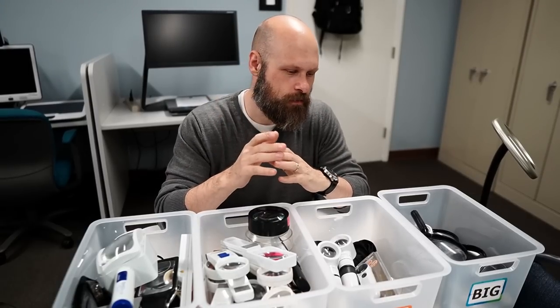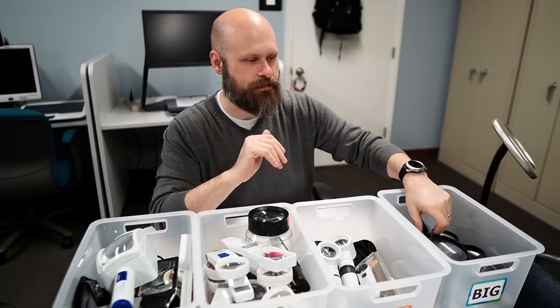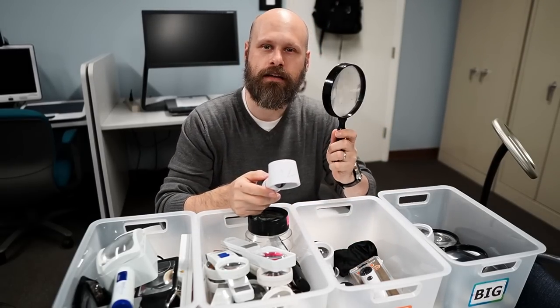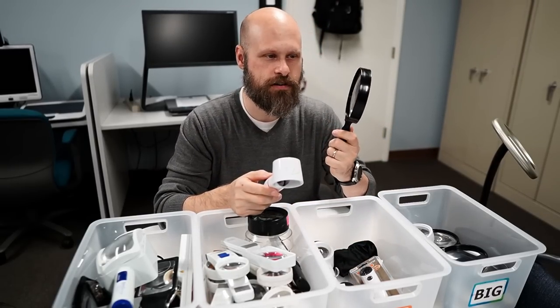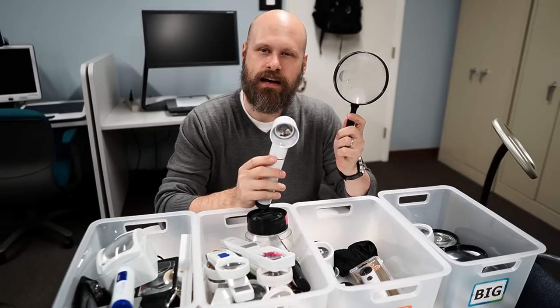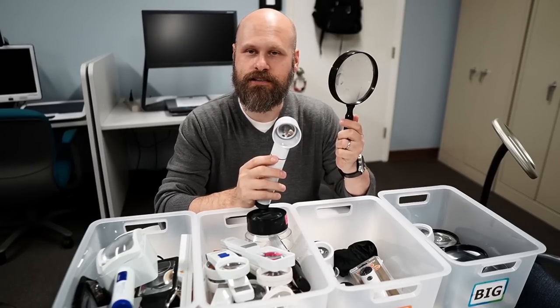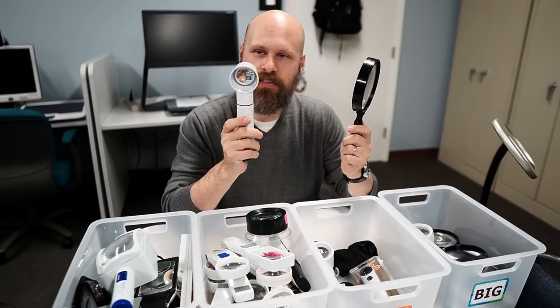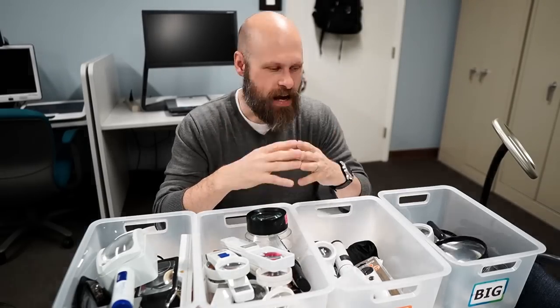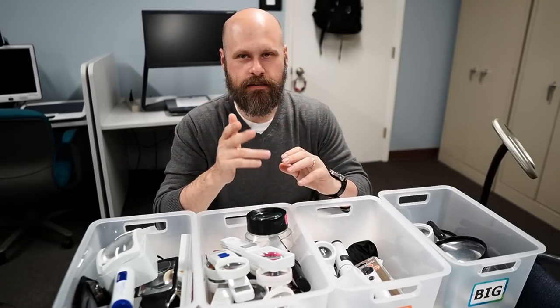One very important thing to remember regarding the level of magnification and the style of the magnifier: as the level of magnification increases — as the strength of the magnifier gets larger — the lens gets smaller. So this one on my left is probably a two times magnification, and this other one on my right is a ten times. That's just the way optics work. Unfortunately, there's no way to get around it, so definitely something to remember.